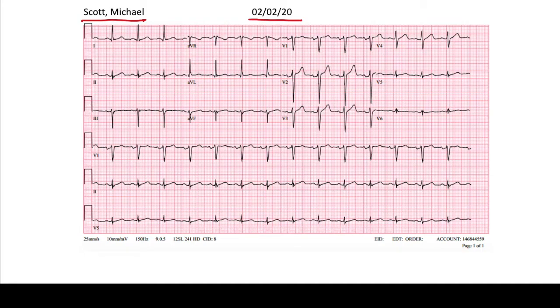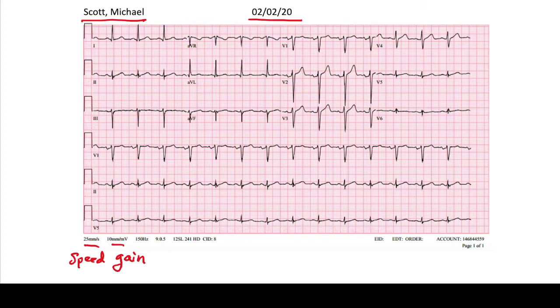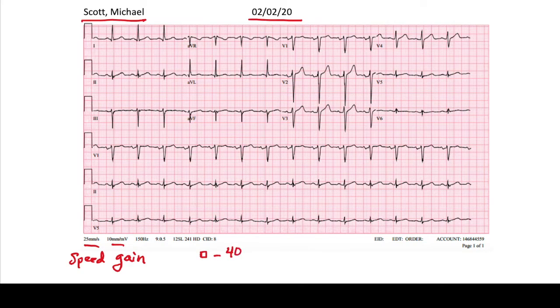After you look at the name and the date, the next thing to look at is the speed and the gain — the numbers at the bottom of the EKG. This is rarely looked at and not always taught, but it's really important because if these aren't normal, all the rules we use to read EKGs will be completely off. The speed represents how fast the EKG paper is moving. The normal speed is 25 millimeters per second. At this standard speed, one little box equals 40 milliseconds and one big box equals 200 milliseconds, with each big box containing five little boxes.